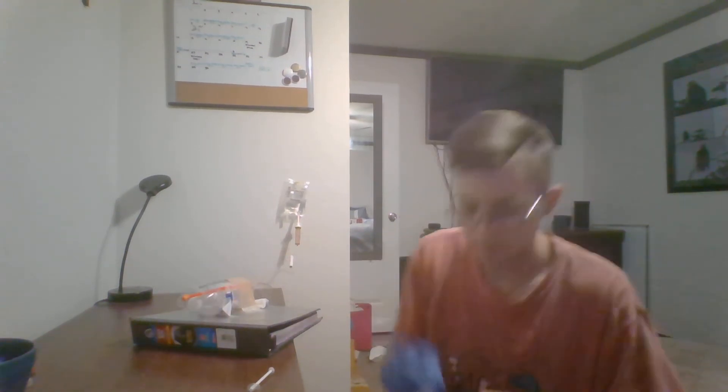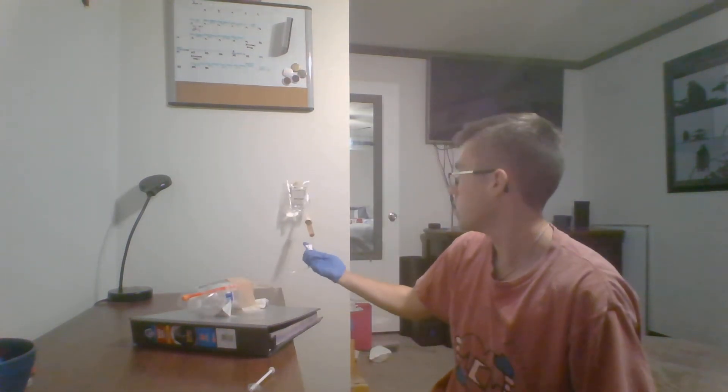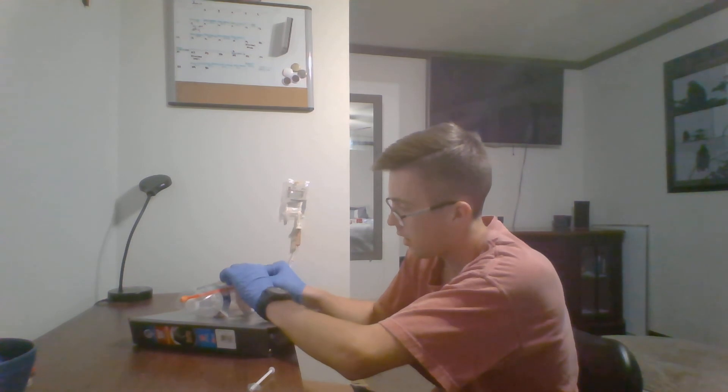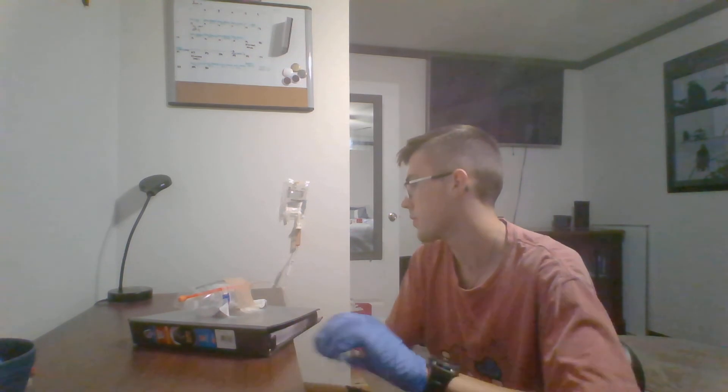Then I'm going to put on proper PPE. Then I am going to cease the flow on the IV and remove the tubing. I'll grab my antiseptic solution and clean either my hub or a Y-port. Since I don't have a Y-port, I'm going to be cleaning my hub.